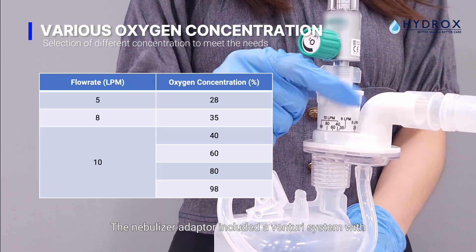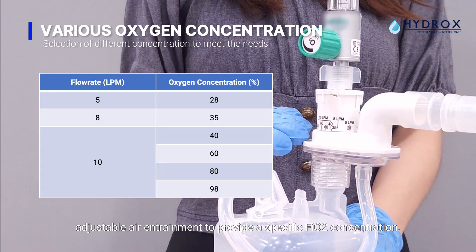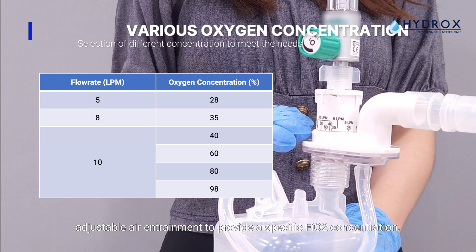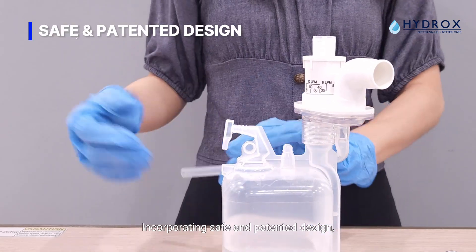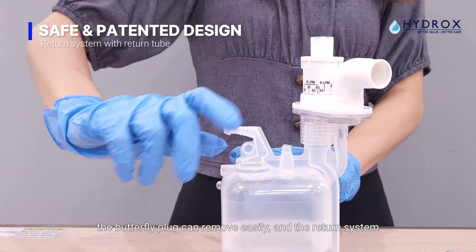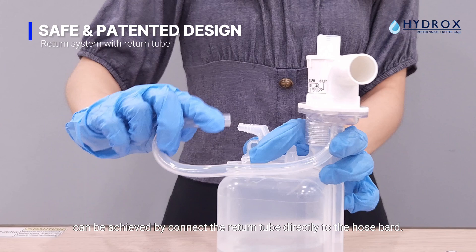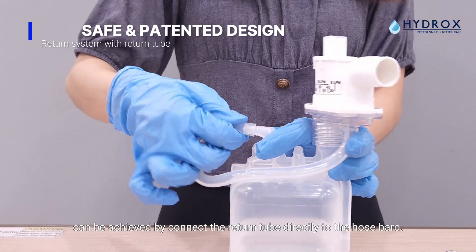The nebulizer adapter includes a Venturi system with adjustable air entrainment to provide a specific FiO2 concentration. Incorporating a patented safe design, the butterfly plug can be removed easily, and the return system can be achieved by connecting the return tube directly to the hose bar.